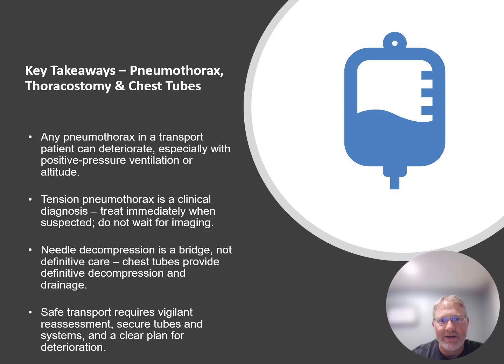But if not, then needle decompression and constant monitoring for any signs of air reaccumulation is extremely important. Finally, safe transport of these patients depends on vigilance. Constantly reassess their breath sounds, work of breathing, airway pressures, hemodynamics, and chest tube function.